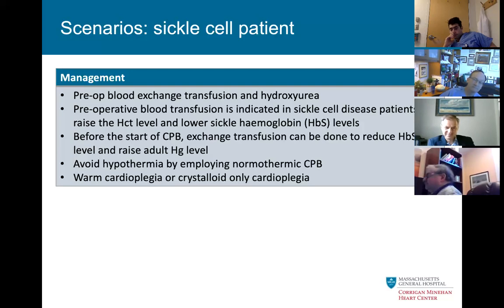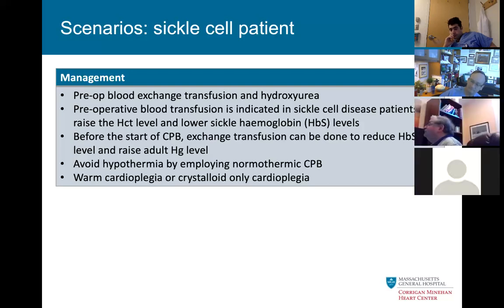I think you'd better be careful with that one on the boards. I don't think that'll be on there, but I've avoided cold cardioplegia in the past at the recommendation of colleagues. I would not do it. I would not do it either.